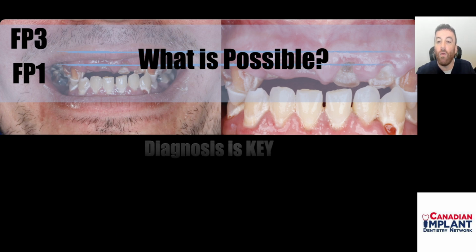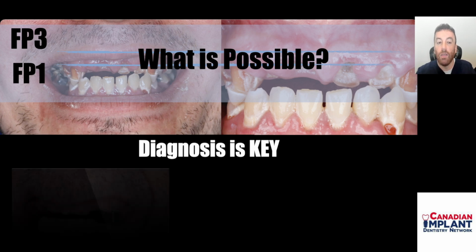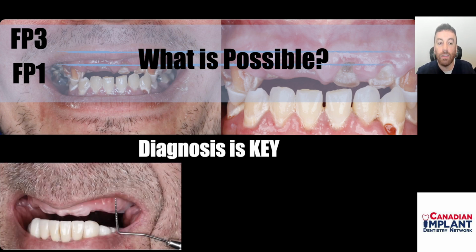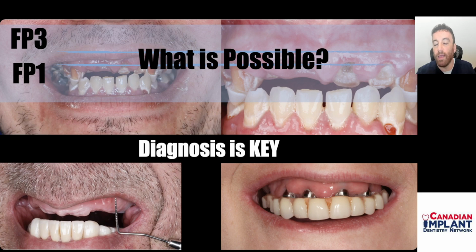And I think it's important to understand that it always begins with diagnosis of your case. So for patients that have a very high smile, such as this edentulous case, that bone for sure has to be taken away. Because you don't want to end up like this.